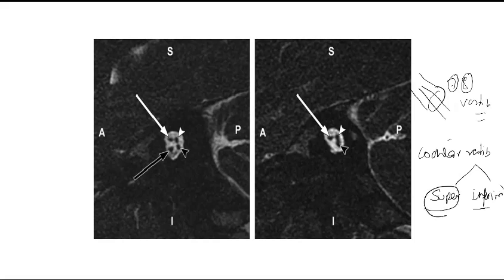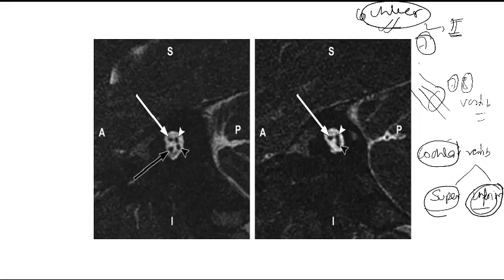To see these, suppose the cochlear modiolus is seen in the picture, then there will be the inferior vestibular nerve and the cochlear nerve. If the cochlear modiolus is not present, then it will be the seventh cranial nerve and the superior vestibular nerve.